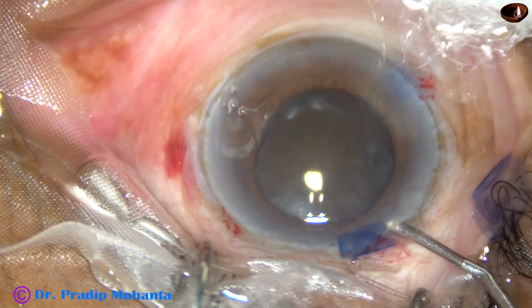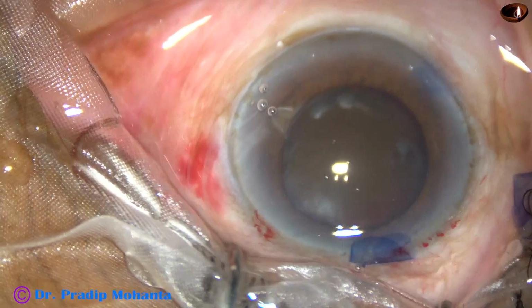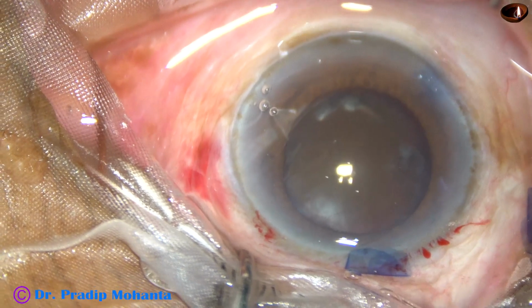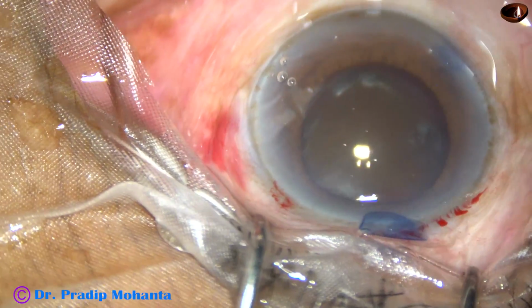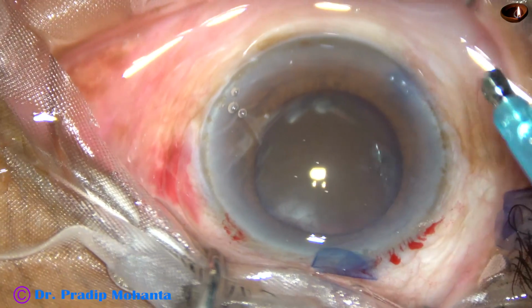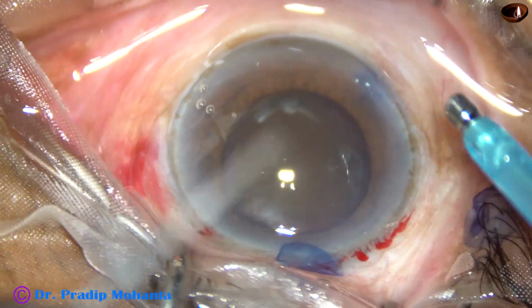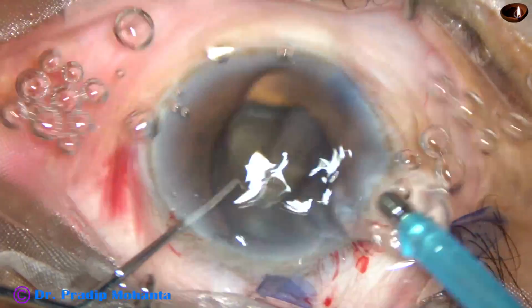The pupil is mid dilated in this case, so we have to be very careful in management of the nucleus, particularly when we separate the pieces. We apply opposite forces after chopping. We must take care of that part when the pupil is mid dilated.